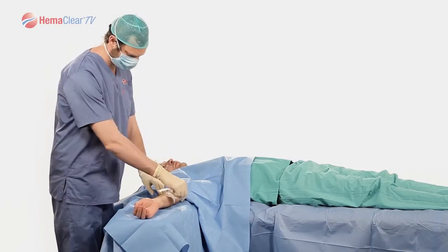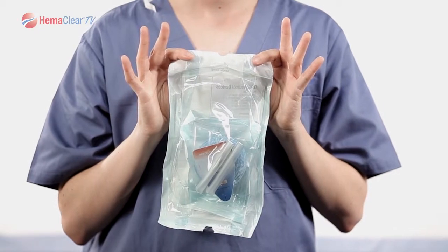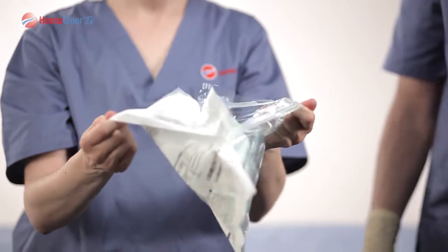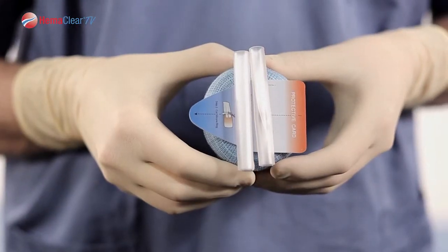Once it has been determined that the patient's forearm fits within the Model F size guidelines, open the sterile packaging introducing Hemoclear to the surgical field. Note that the packaging is dual peel packed. Be sure to save the Hemoclear cutting card for the end of the procedure.